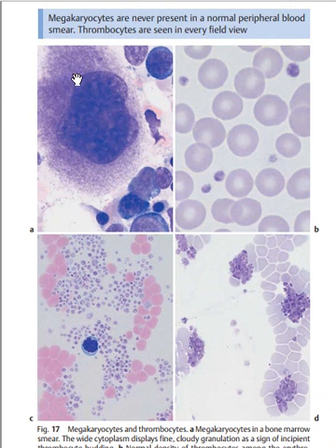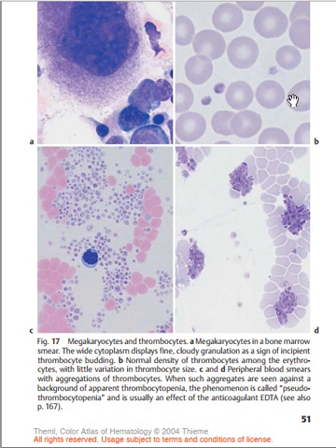In this first diagram here, you are going to visualize megakaryocytes. They are very large. In the thrombopoiesis of megakaryocytes, it starts from the megakaryoblast, then goes to megakaryocytes, then to the thrombocytes due to the fragmentation of the cytoplasm of the megakaryocyte. So here in diagram A, we have megakaryocytes in the bone marrow smear. Is it clear? Then in diagram B, we have a normal thrombocyte. You can visualize the thrombocyte here. Is it clear?